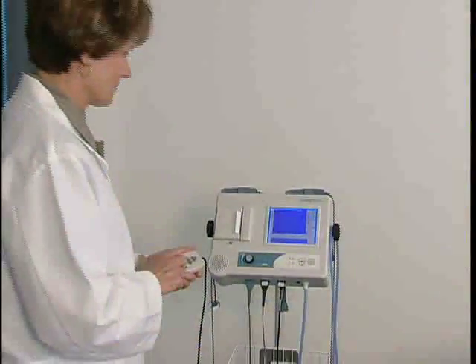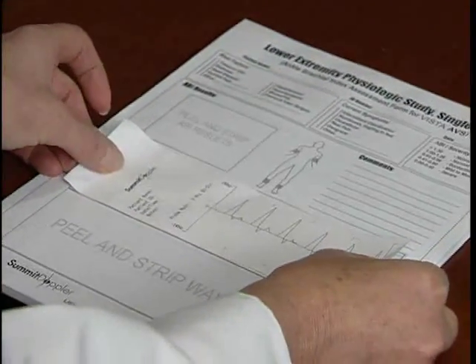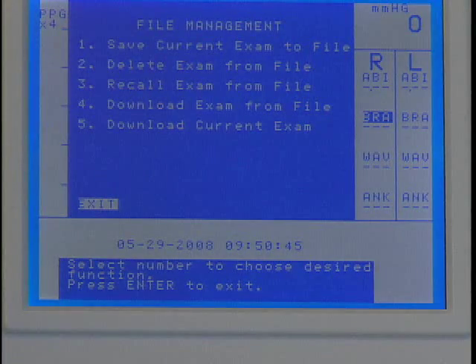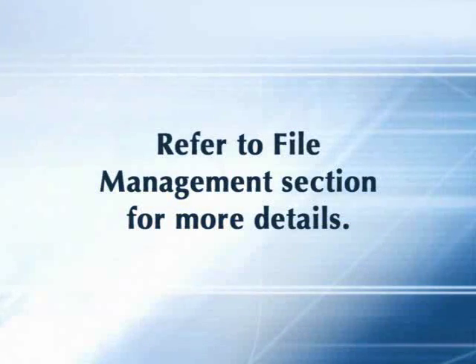After completing the exam, press Print and apply the adhesive-backed labels with the exam results onto the report form. Alternatively, save the exam to one of the 10 storage locations as explained in the file management section of this video.